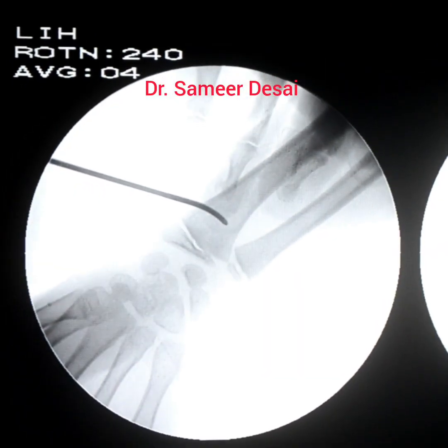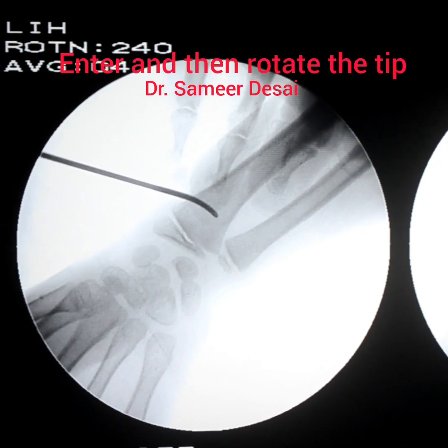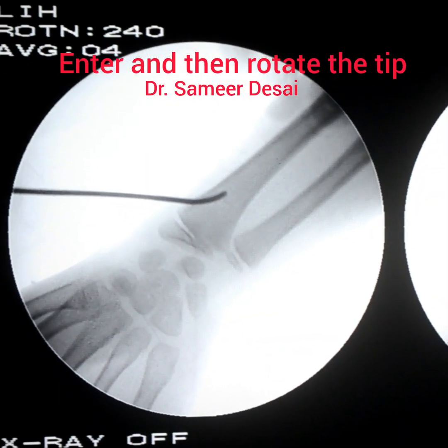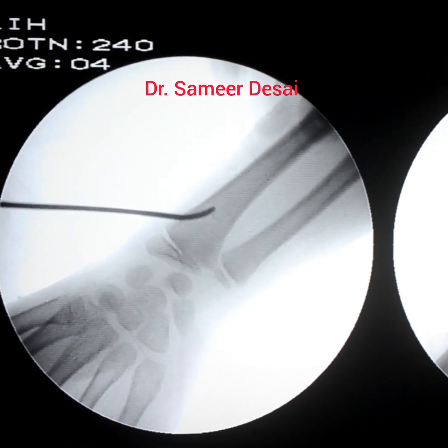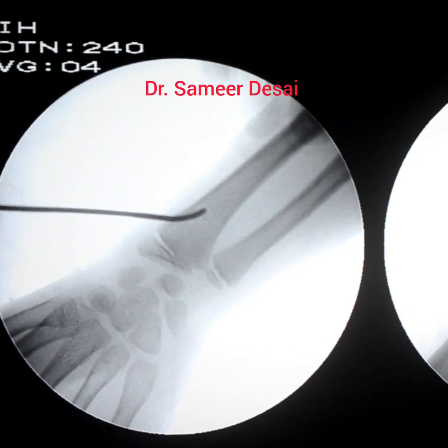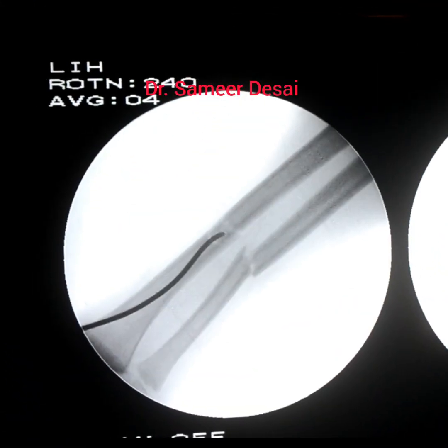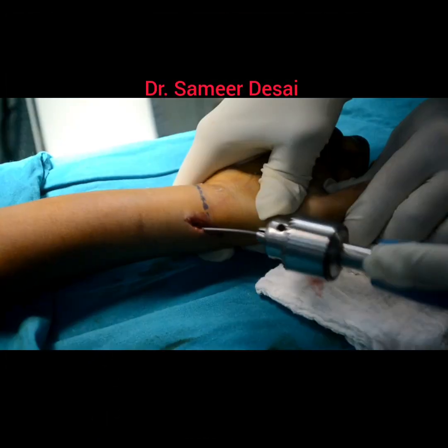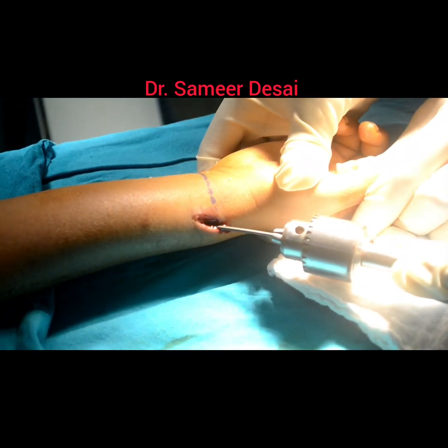Insert the nail in this fashion, and then rotate the tip. Advance the nail using short rotatory motion.